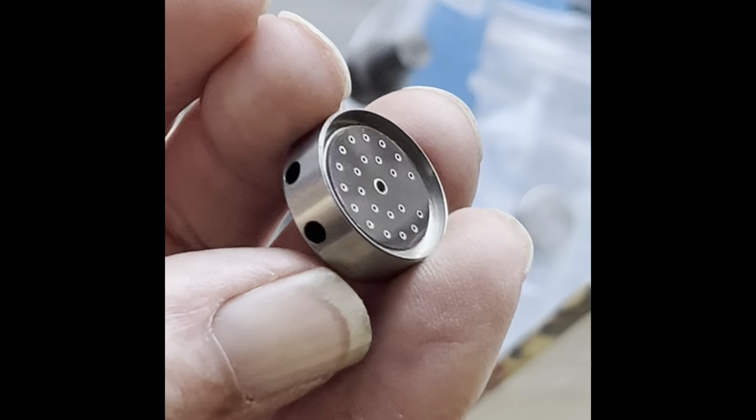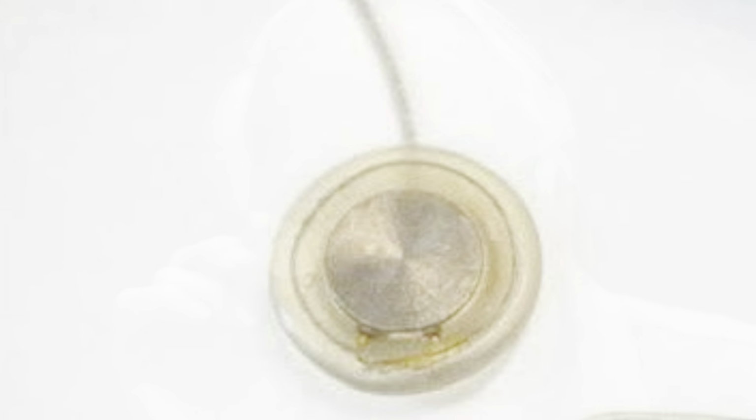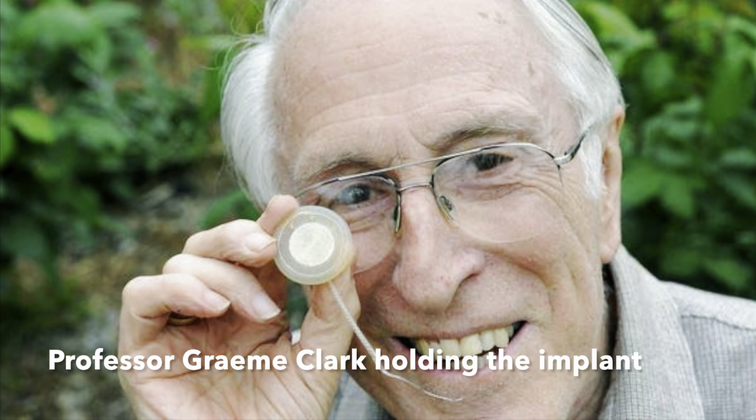The next thing, they had a wire coil in there that came out of 2 feed-throughs in the titanium piece that was connected from the inside to the outside. This big coil was going to be read by another device once it was implanted. But they said, you can't just implant this, it's got to be in some sort of silicon housing. So I ended up making a mould out of brass, and I moulded these for quite a long time.